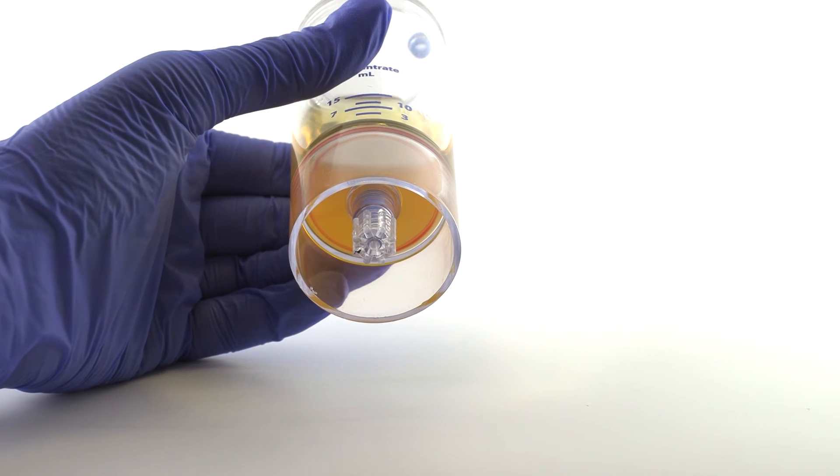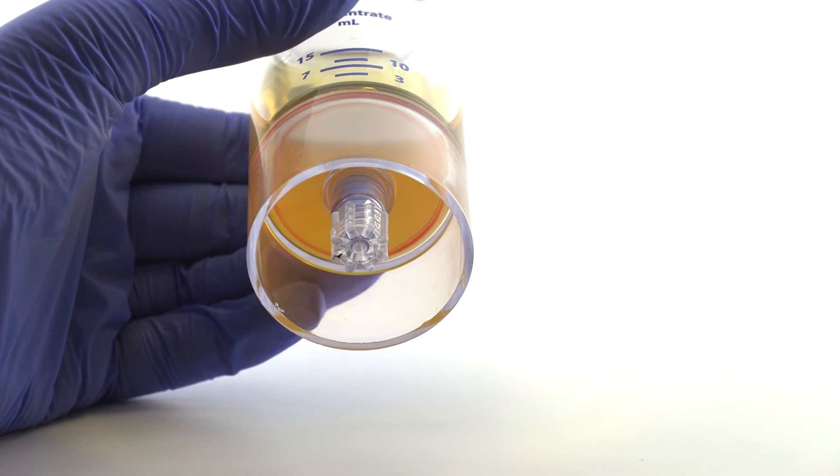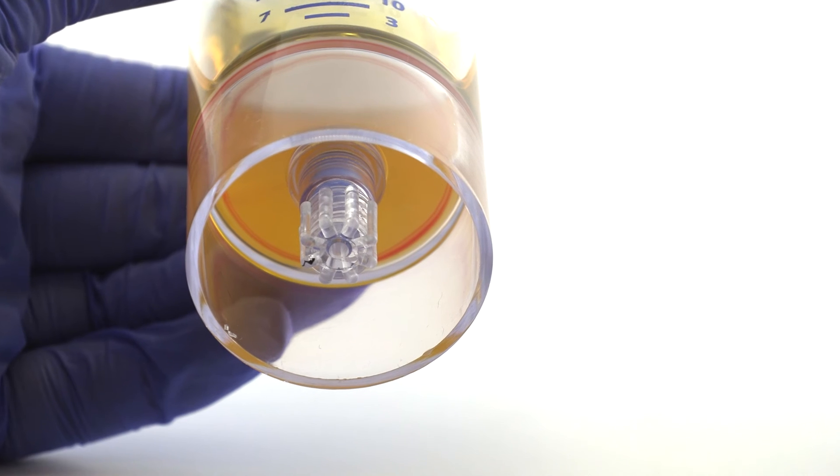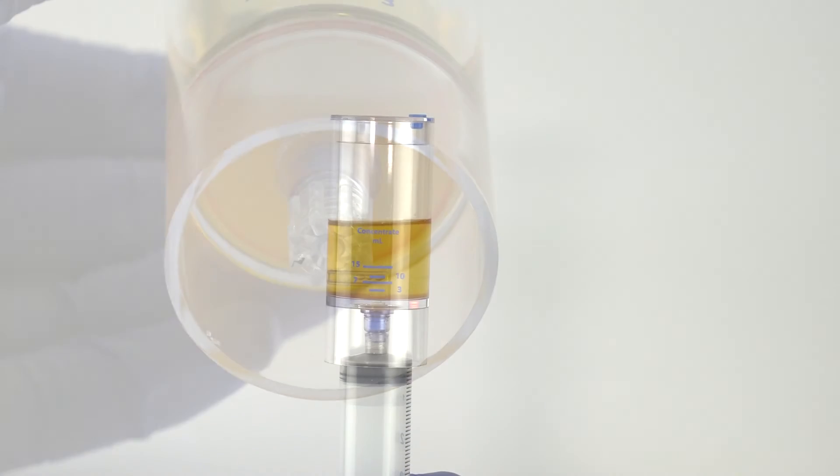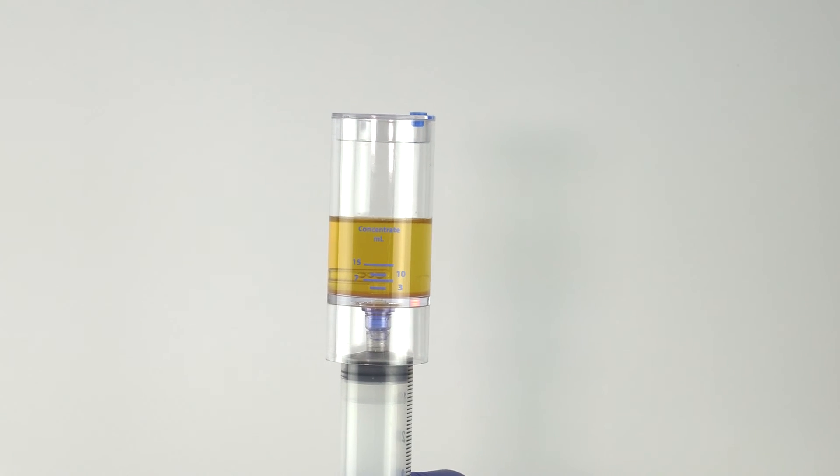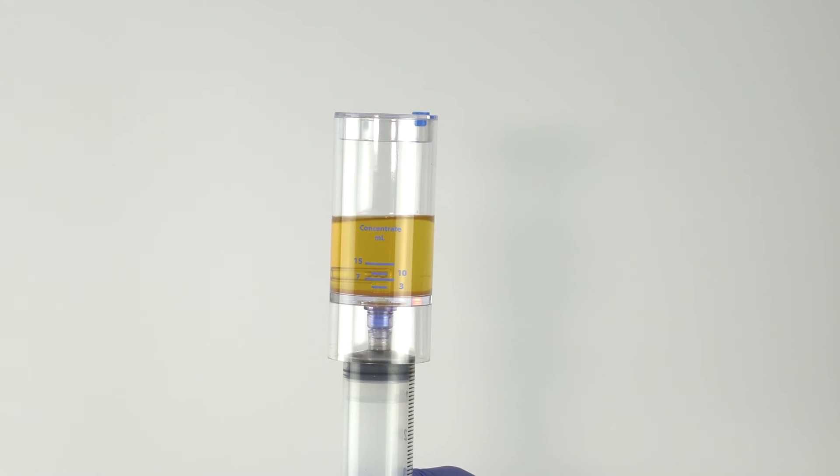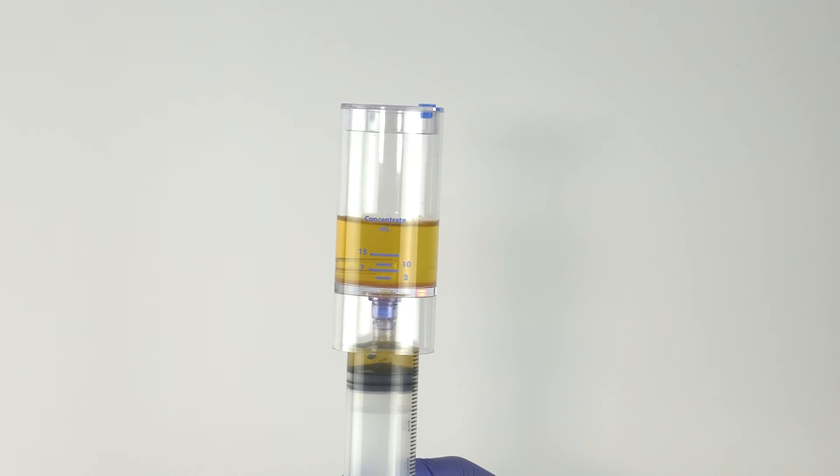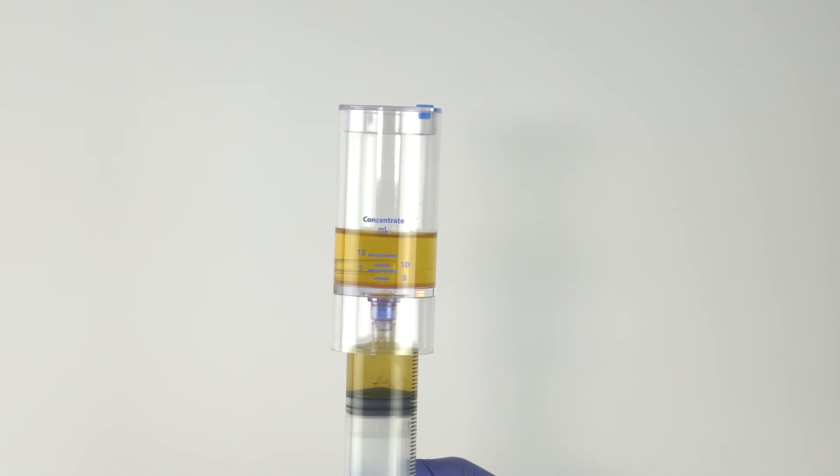After centrifugation, the platelet buffy coat layer will be clearly visible at the bottom of the device. Attach a sterile syringe to the needleless port and aspirate plasma, leaving 7 milliliters or the desired amount in the device.